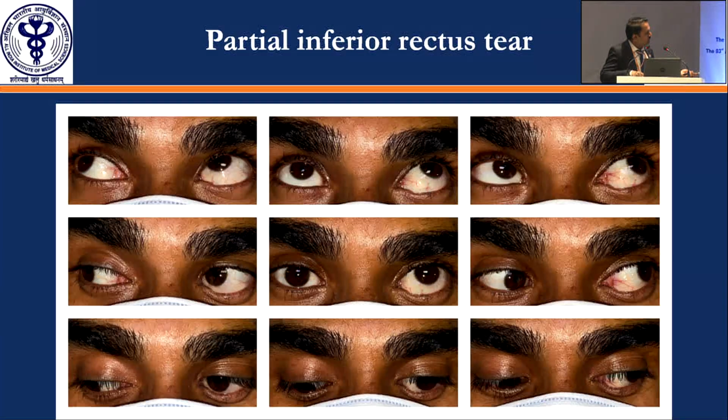You can see lid notching also. He has injured his inferior rectus, and there is a hypertropia here. Again, the CT scan or the MRI will not be able to give where the muscle is on the sclera. He is lacking infraduction, which is very bad.